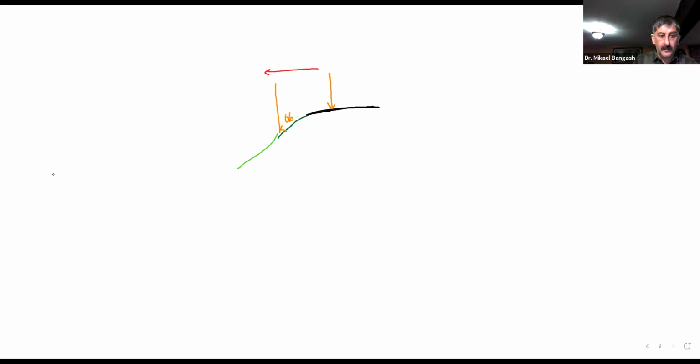Even if you say my transducer was like this, you have the same structure, which means it just lies in the same position. But you switch the angle of the transducer a little bit, and now that beam is not going to be at a right angle.